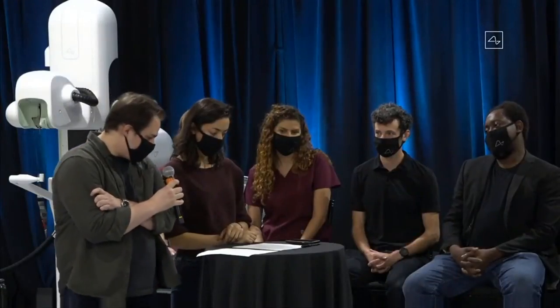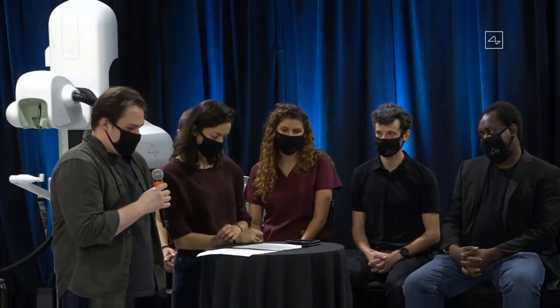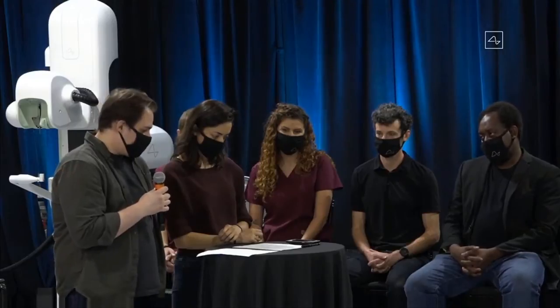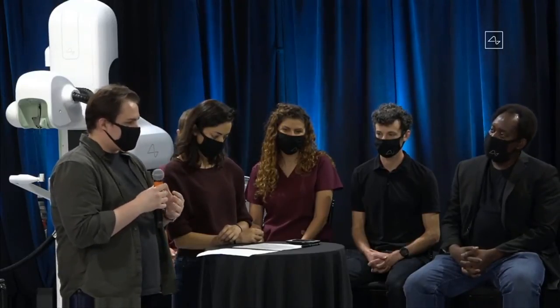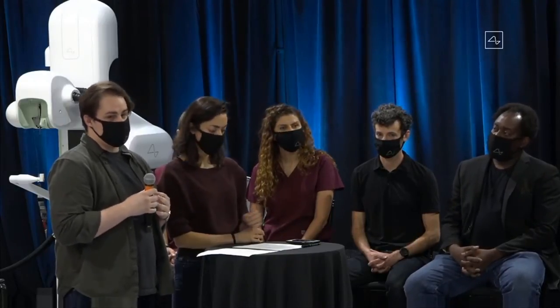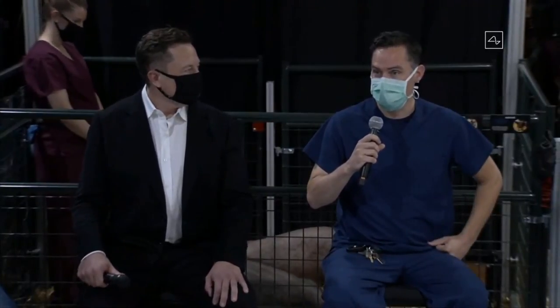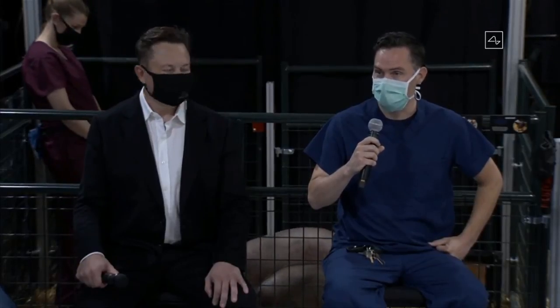Awesome. We'll pull back out from the Twitter questions that are kind of funny. This is a question for the efficacy of the device. Right now, is the device limited to surface layers of the brain only, or can we go deeper? And if not now, what's holding us back from going deeper into the brain? We are planning on modifying the device and the robot to be able to sew into arbitrary depths of the brain. Right now, we're limiting ourselves only to the cortical surface because that simplifies many of the problems involved with going a lot deeper. And what kinds of things can you solve on the cortical surface versus when you go deeper?